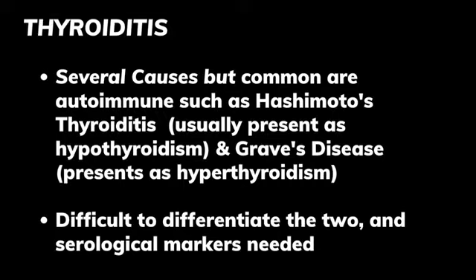In this, the commoner of the two is Hashimoto's thyroiditis, that usually presents as hypothyroidism, and the other is Graves' disease, that usually presents as hyperthyroidism. On ultrasound, it is difficult to differentiate between these two, and serological markers are required for a definite diagnosis.